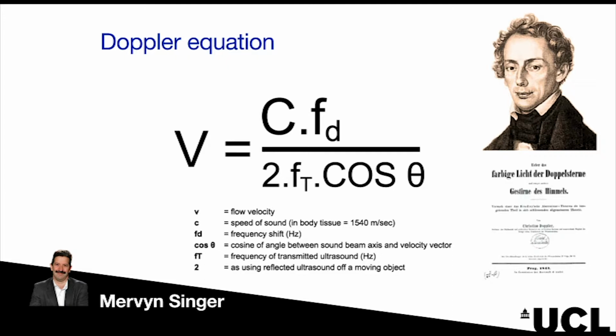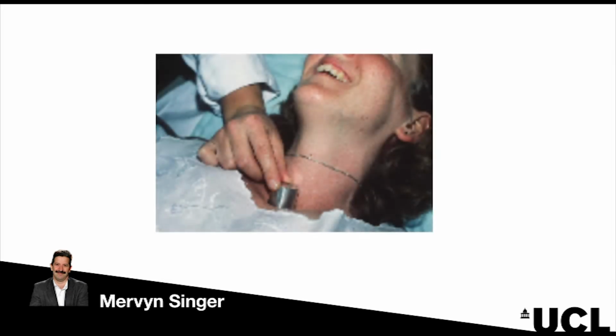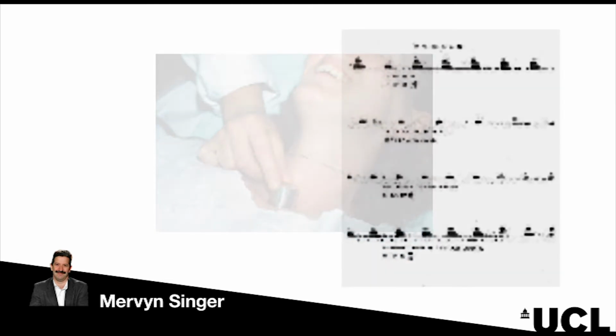And with the Henry Light method, the probe was quite a big chunky probe. It sat on the patient's neck, and you directed it towards the descending thoracic aorta. Ideally, in my view, you'd want to look at the ascending aorta, but the probe design was such that it was too chunky to get behind the suprasternal notch. However, I tried it and got very good signals, and in those days you got strips of toilet paper that sort of came out.